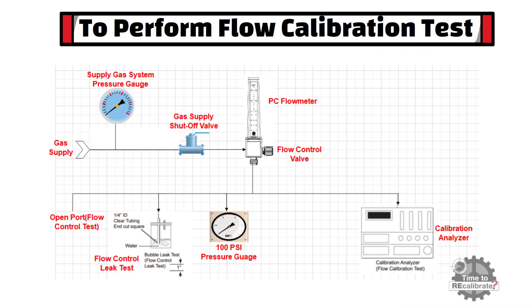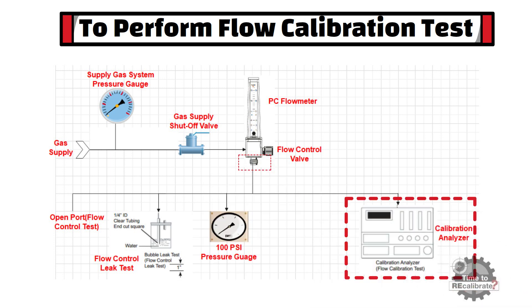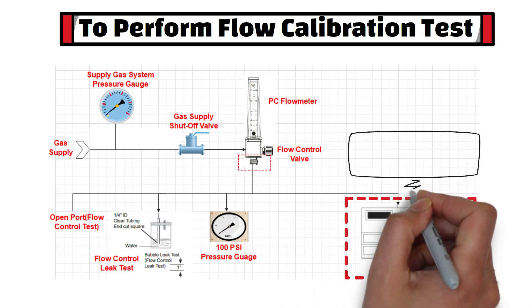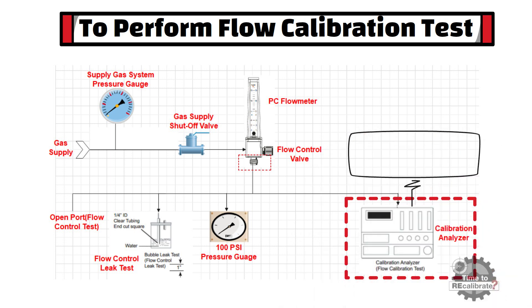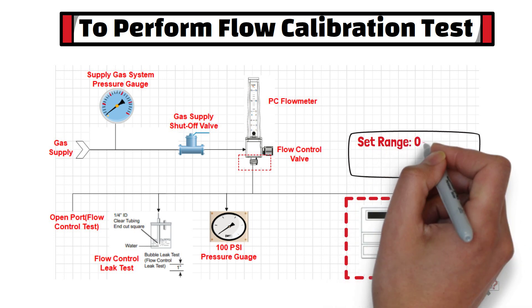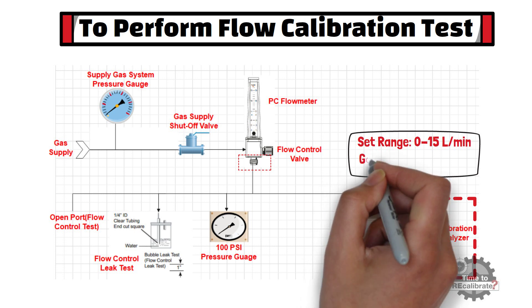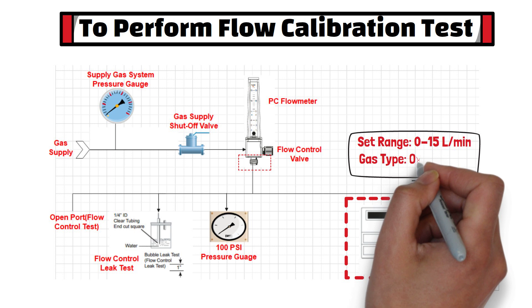As you can see, this is a typical setup for the flow calibration test. In this setup, the oxygen flow meter outlet is connected to a flow calibration tester. In addition, we need to set the range and gas type in the flow calibration analyzer. For example, if the oxygen flow meter's maximum range is 15 liters per minute, then we need to set 15 liters per minute in the calibration analyzer. We also need to select the type of gas — in this example, select oxygen gas.